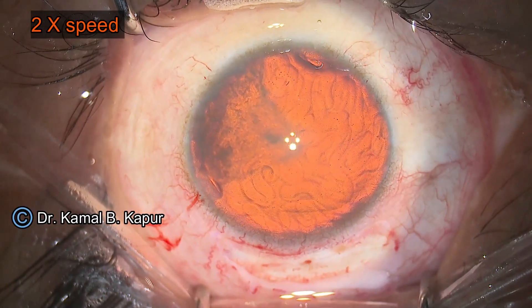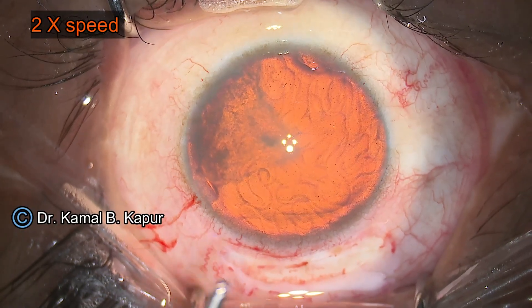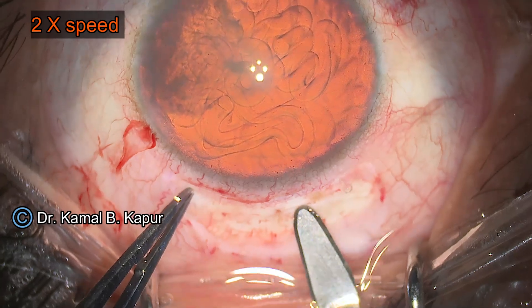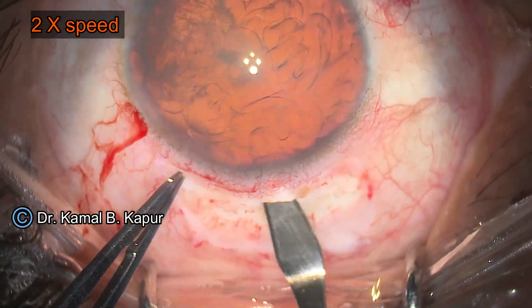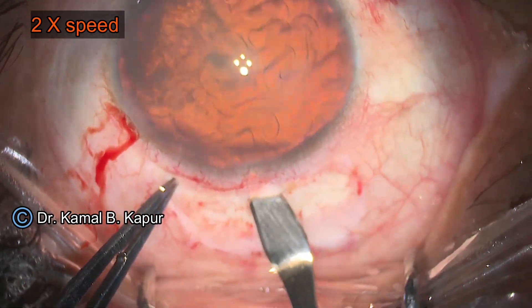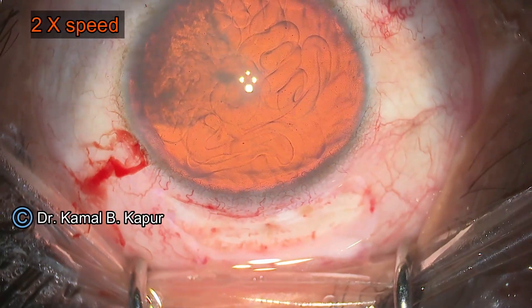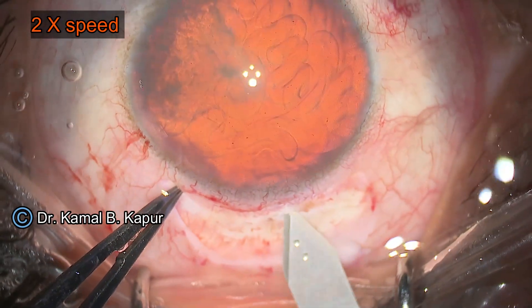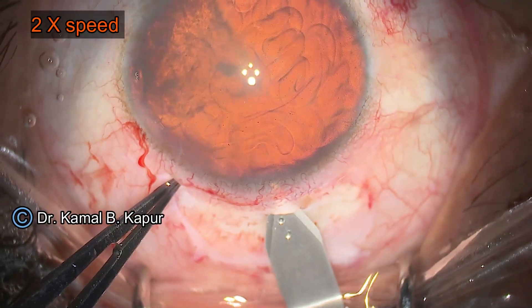We instill viscoelastic to make the globe tight. Once the globe is made tight, we make the tunnel slightly wider and approximately half a millimeter into the cornea. Once that is done, we use a 2.8 millimeter keratome to do the phacoemulsification.